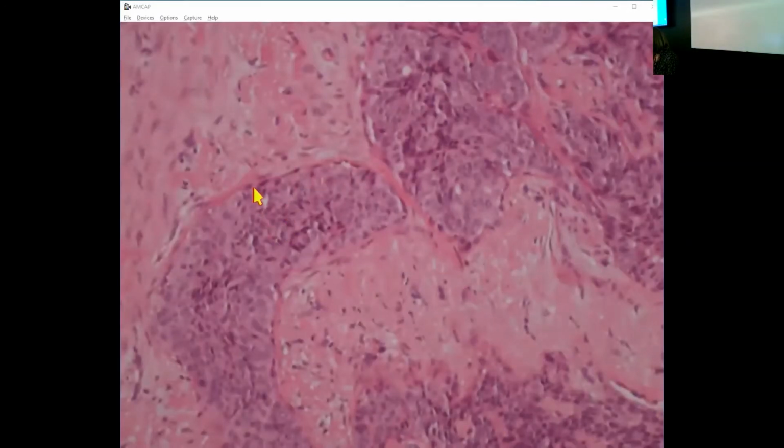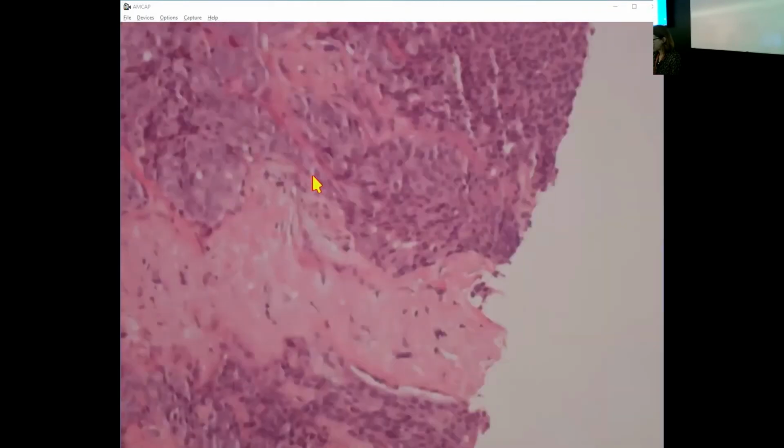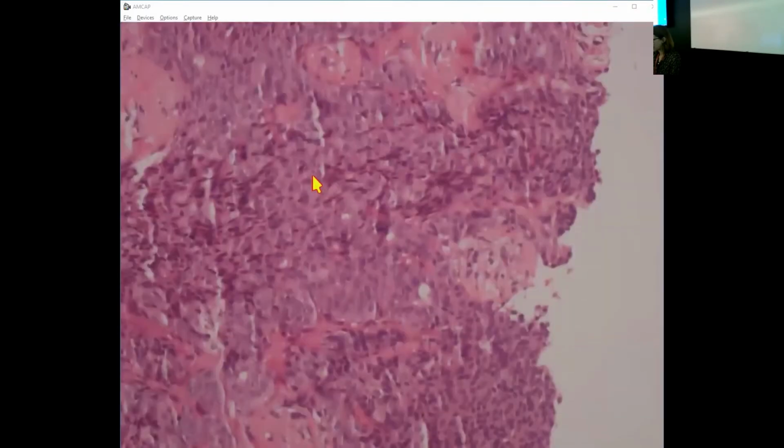And honestly, if you keep an open mind, you'll not anchor on the diagnosis of invasion, and you'll not overlook the myoepithelial cells, which I believe are there. And the basement membrane too, I think, is outlining the nest. Now, you can have basement membrane in invasive carcinomas, but I believe that these are myoepithelial cells. And I think this profile does have, let me see if I can find the necrosis.